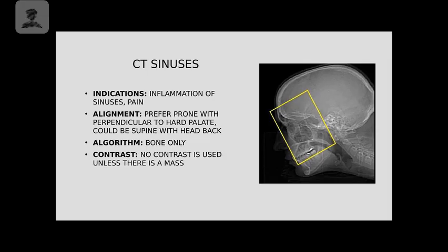Because we are trying to identify if there's also a fracture in the area. Bone just really seems to work better for sinuses. We have so much bone in that area. And unless there's a mass that we're concerned about, we typically will just use bone.